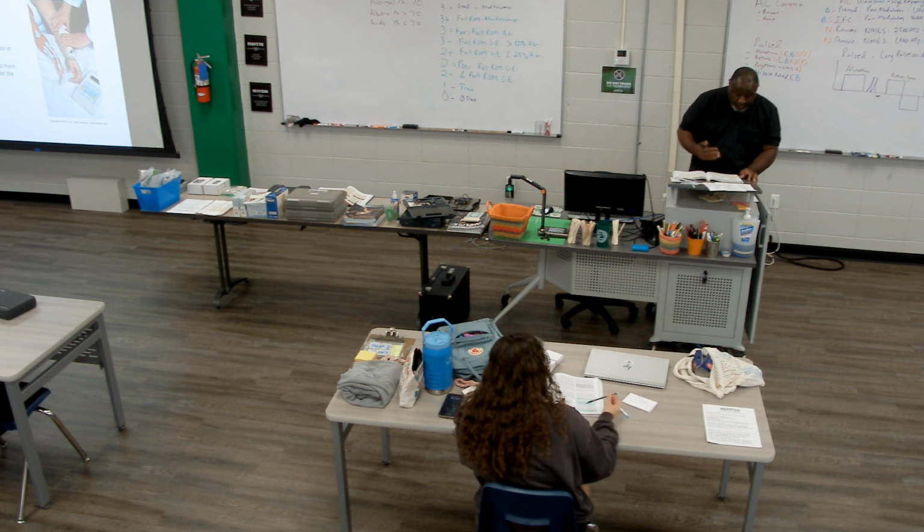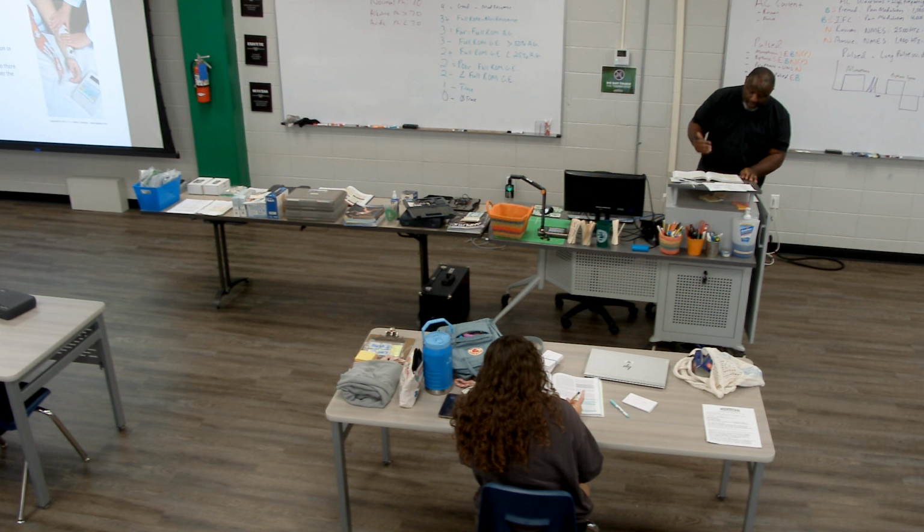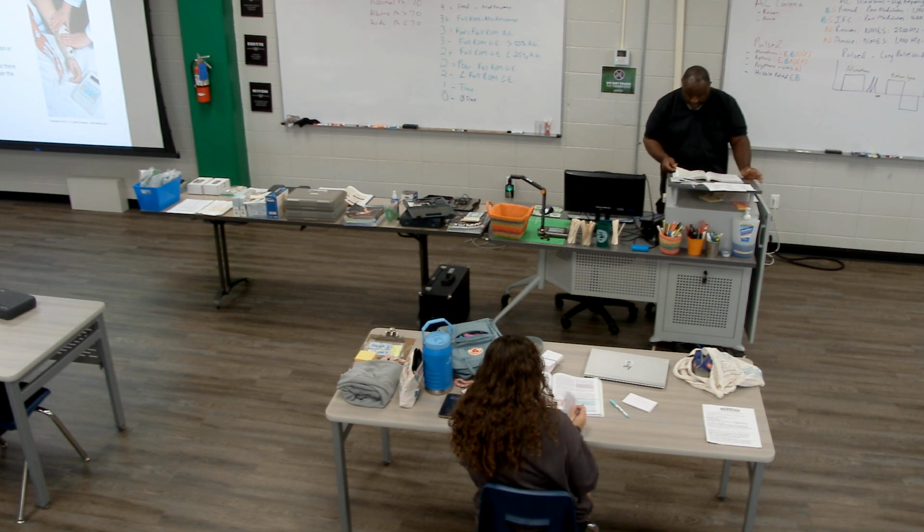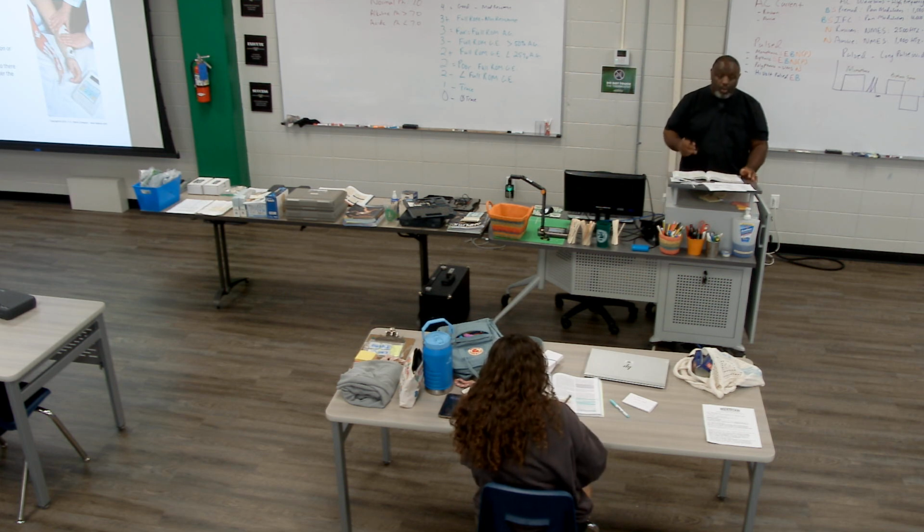Over 296, evidence suggests that iontophoresis transcutaneously delivers drugs through the pores of the skin, and they account for the transappendageal shunt pathway. So that's why we like these hair follicles and sweat glands, because they are the pores into the skin that allow for current delivery.